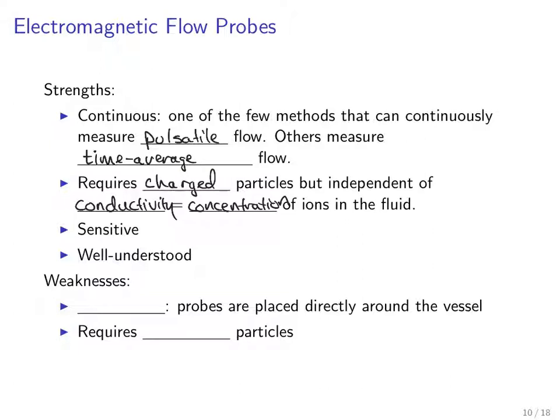The EM flow probes are very sensitive, and the physics are very well understood. They do have some weaknesses, though, in that principally that they are invasive and that they do require charged particles. Nevertheless, they're very widely used in physiology and also in industry.